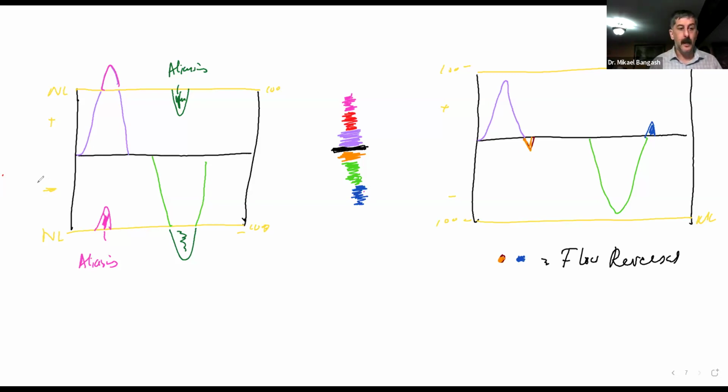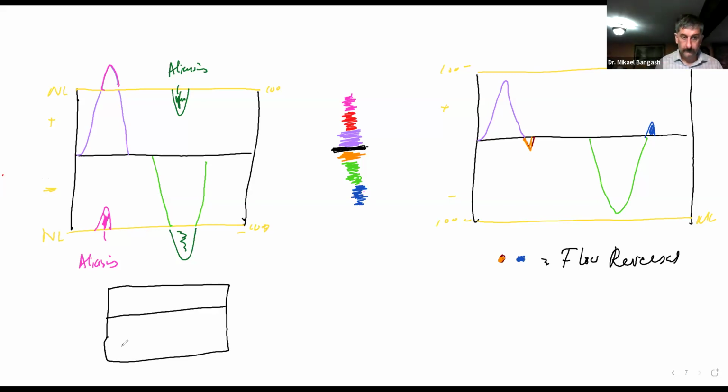Now, guys, on a color Doppler, if we take the aliasing, let's say we take the aliasing with our blood vessel having a positive Doppler shift. So we had the max velocity on our color map was this one here.